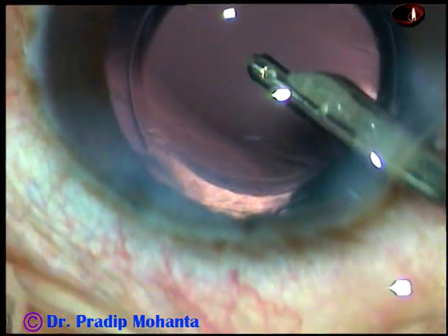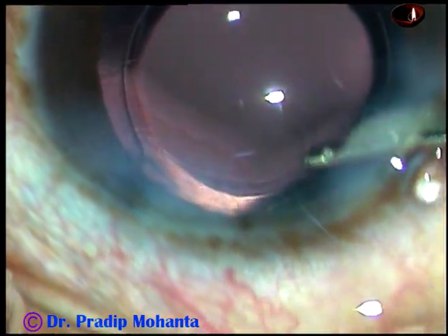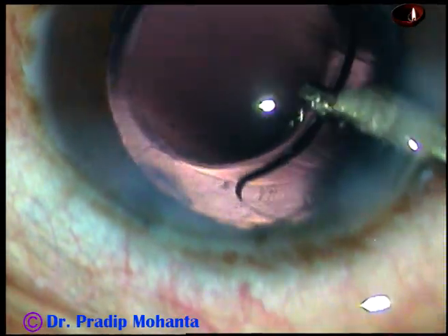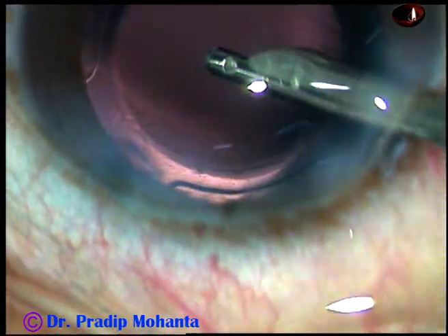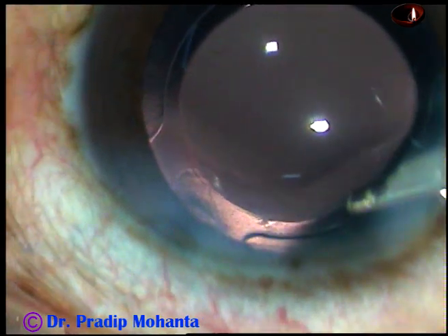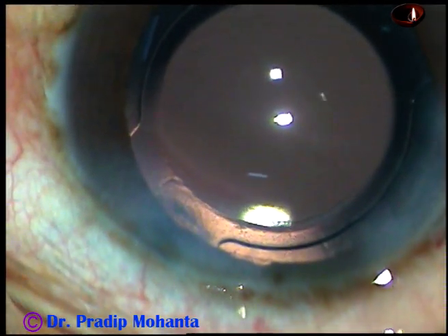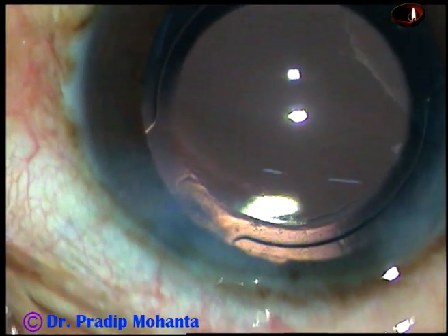So in this case, my aim is mainly to show you the tunnel engage and chop technique. Make a tunnel in the substance of the nucleus in bevel-down position of the phaco needle. Then use reflux, come out, turn the handpiece, make bevel up, engage the tip of the phaco needle into the tunnel, and then chop.